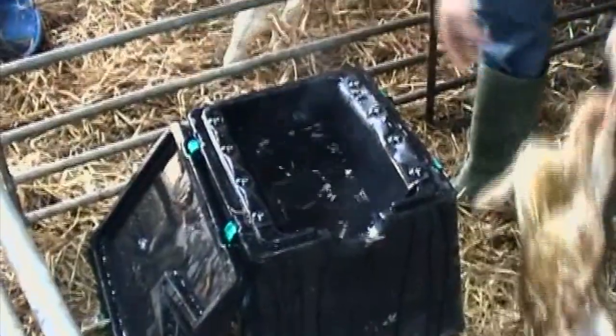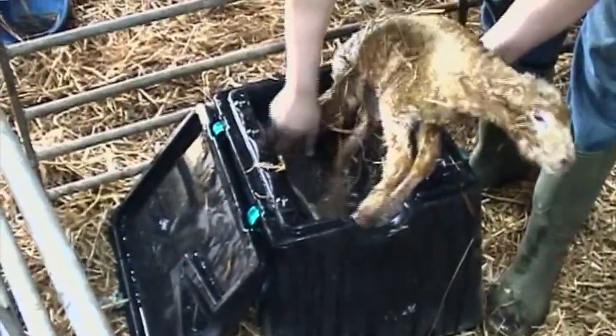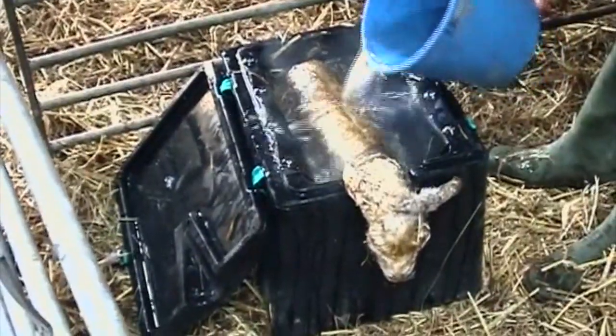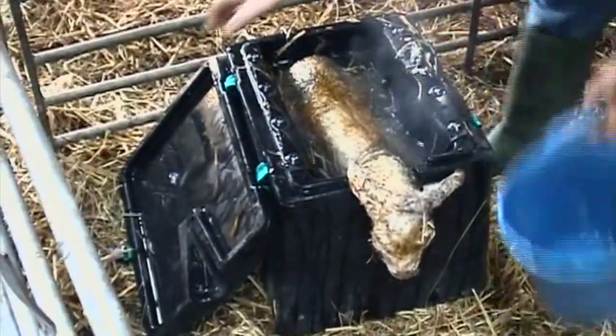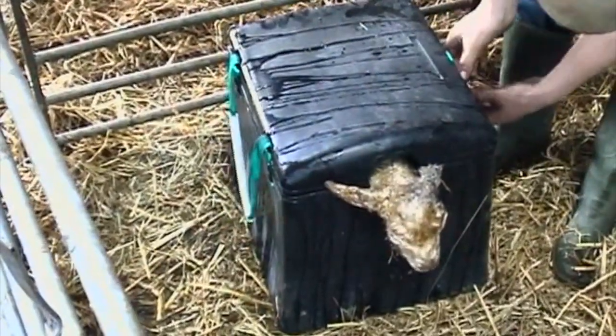The Woolly Warmer is extremely easy to use. Simply fill the vessel with warm water. Place the weak lamb in the sling to hold it in an upright position. Top up with water to maximise coverage of the body. Replace the lid, holding the lamb's head securely out of the water.